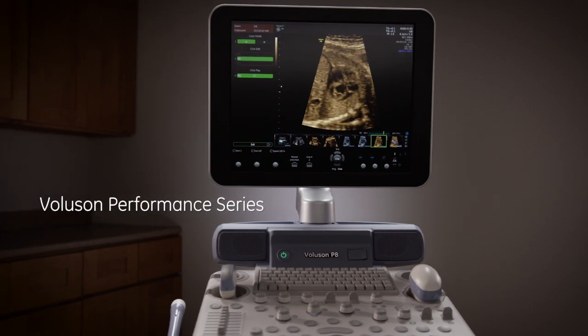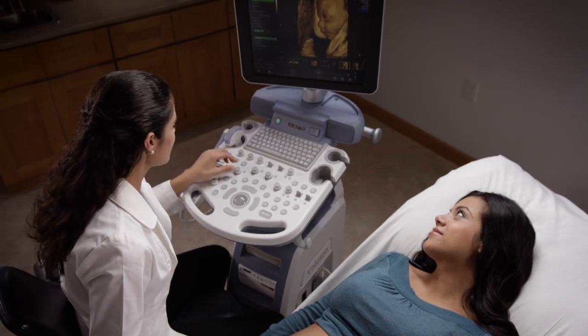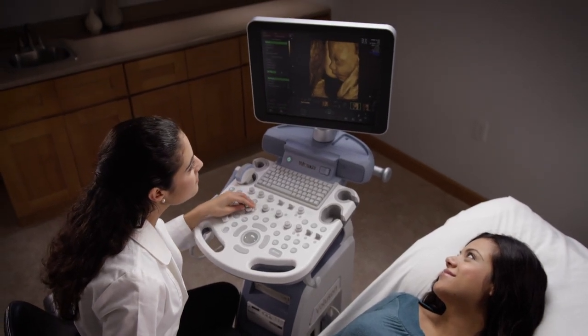The Voluson Performance series is an easy-to-use system with excellent image quality and performance to help meet the daily needs of your practice.